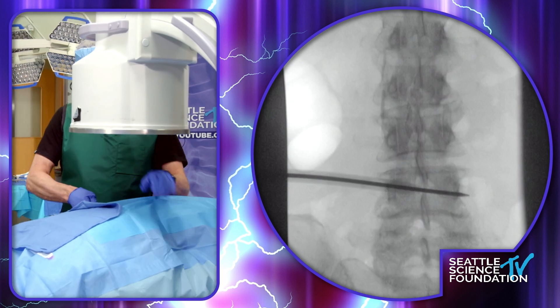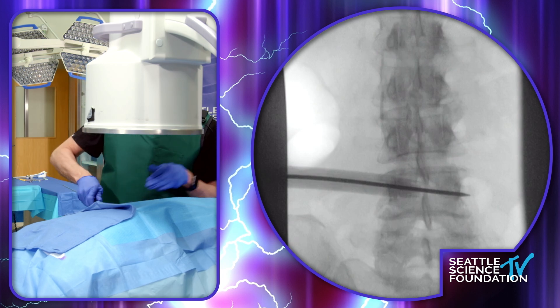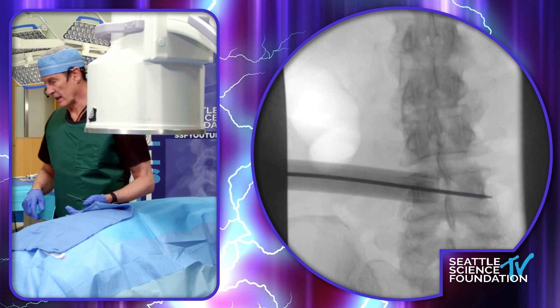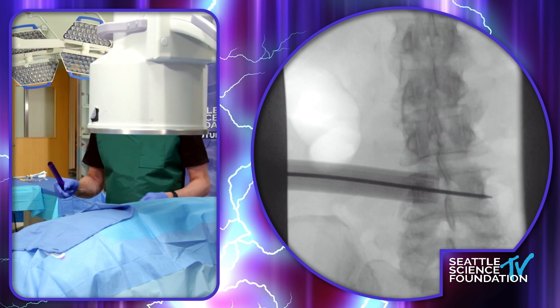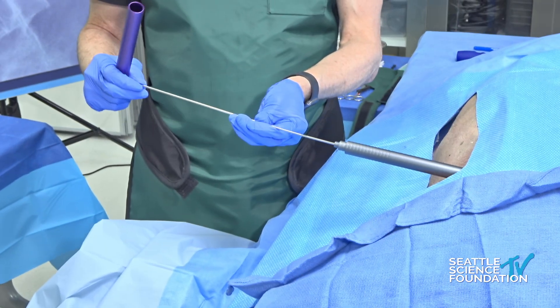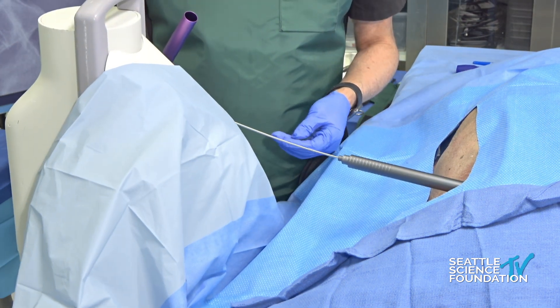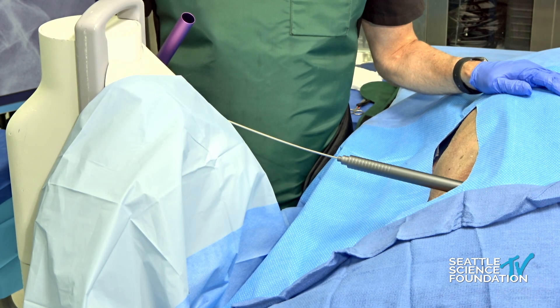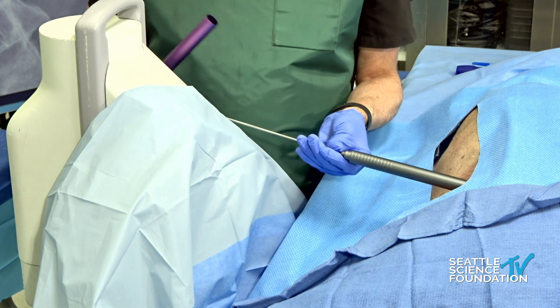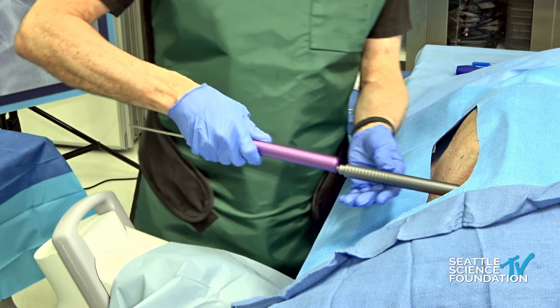This particular cadaver is kind of age-appropriate. Dilator 2, dilator 3. So let's take a quick lateral shot as I put the final dilator in there. This has an extended Steinman pin, and usually it has enough obliquity so you can keep it out of the II. In the permanent system, they have a flexible Steinman pin — a Steinman pin that has a lot of flex to it. So, we're just posterior to that and we will go back around to AP. You want to just be posterior to the inferior articular process in the back.